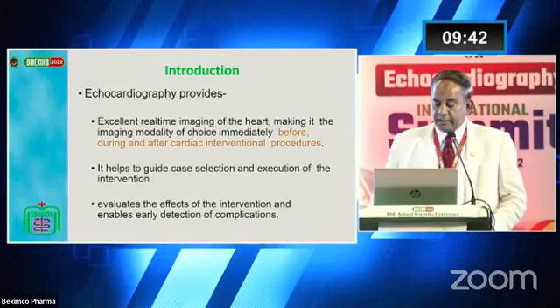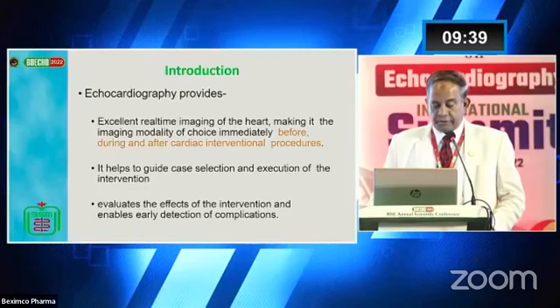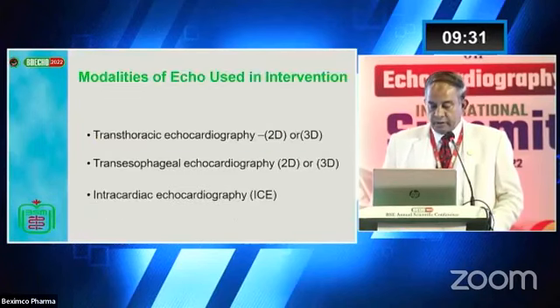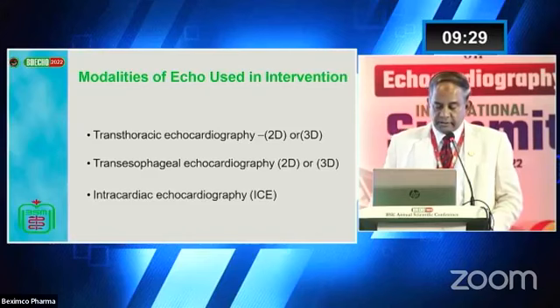It helps to guide selection and execution of intervention and enables early detection of complications. The modalities of echocardiography may be 2D or 3D, transesophageal 2D or 3D, and intracardiac echocardiography.